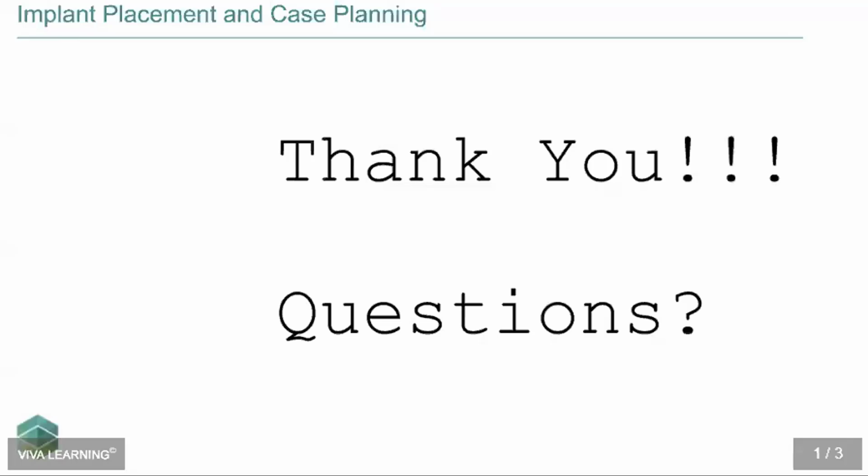It is wildly successful. We also use PRF technology, which we didn't get into today, but I don't believe that really translates to anything about the abscesses. So I say absolutely yes. For that question, we absolutely do. I don't really even worry about abscesses unless they are really, really massive.